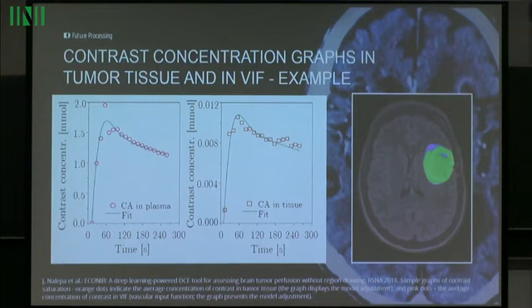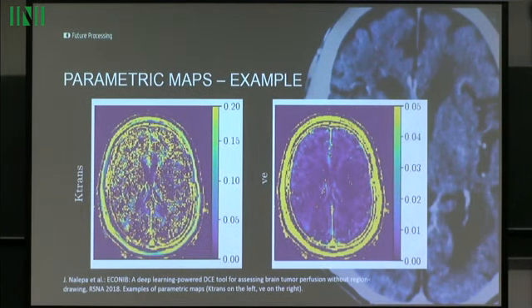So we need to be able to monitor and quantify and compare the curves extracted for a given patient in time. That should be robust. And here's an example of how we can visualize the numbers. If we extract just two numbers, which are K-trans and Ve, we can have the visualization for every single voxel in the image. That might not be the best example, but the tumor is somewhere over here.